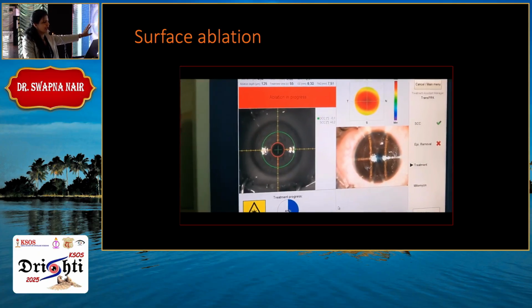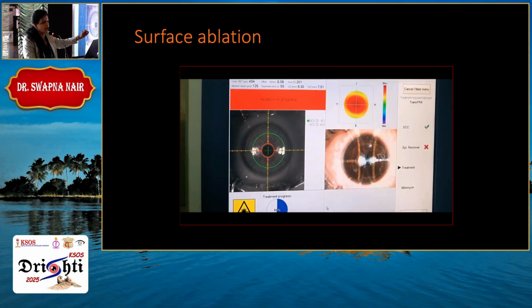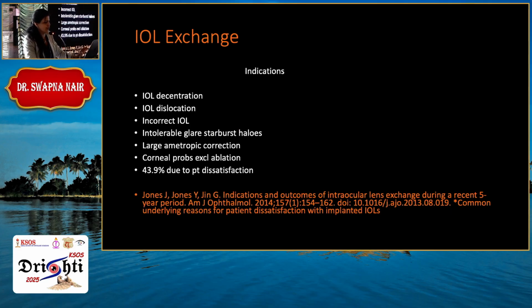You're not touching the eye other than to place the mandatory mitomycin for a short amount of time. So this is one procedure I definitely prefer for any patient who has undergone an intraocular surgery. Now comes the second option.